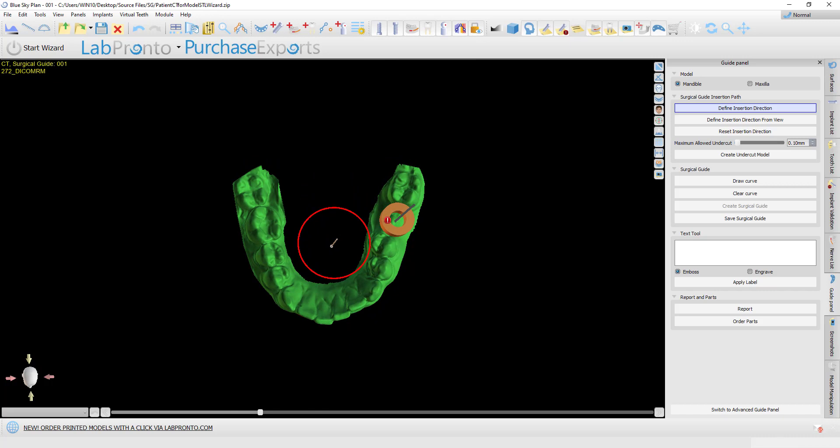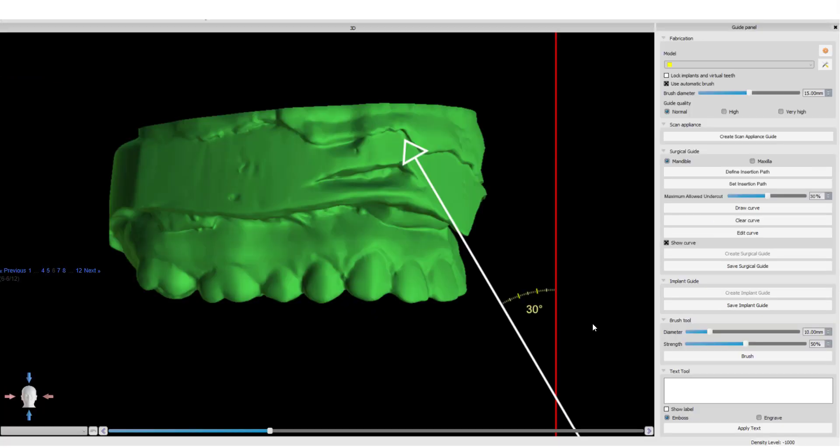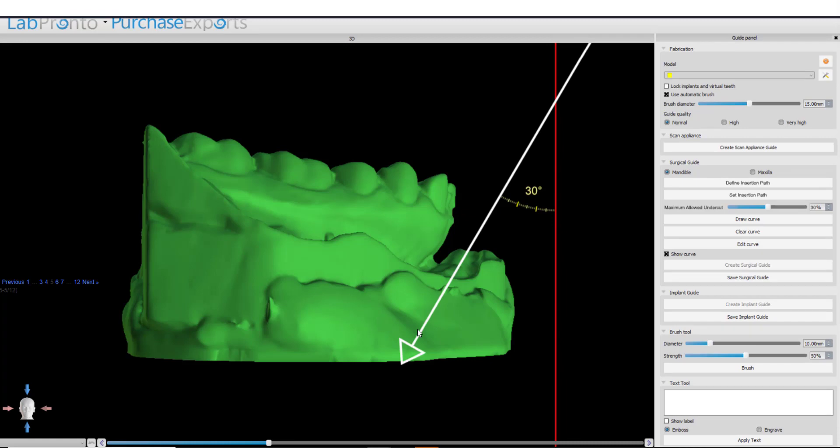In the wizard process flow, we defined an automatic default path of insertion at 30 degrees for the upper and lower jaws.